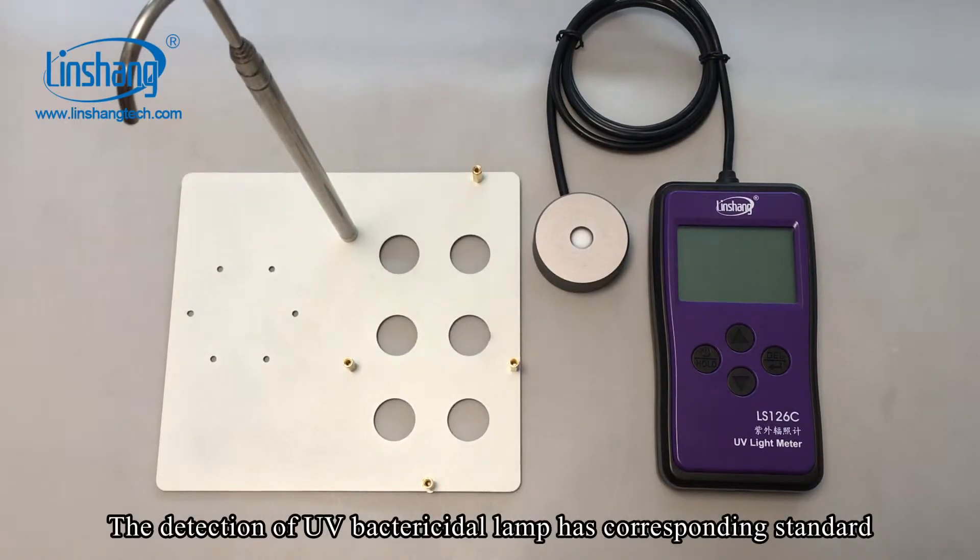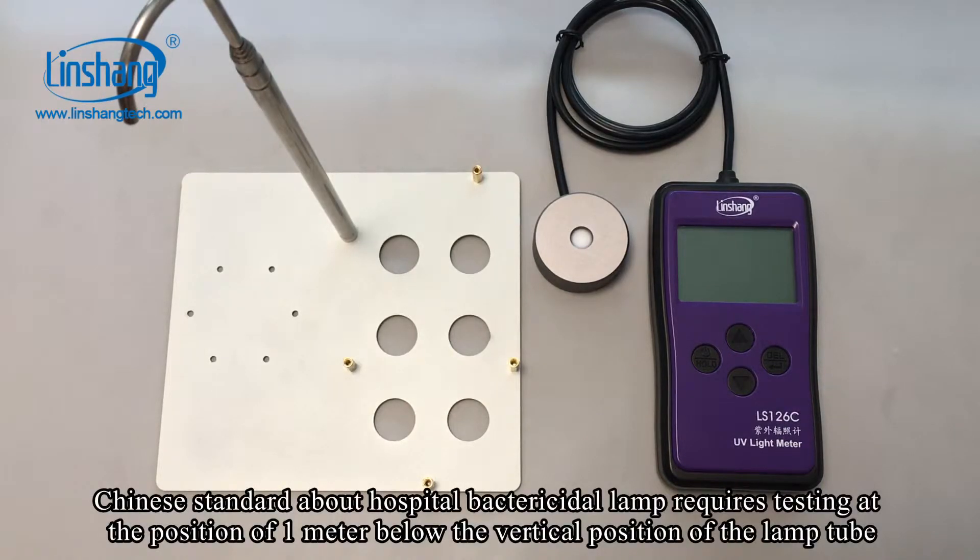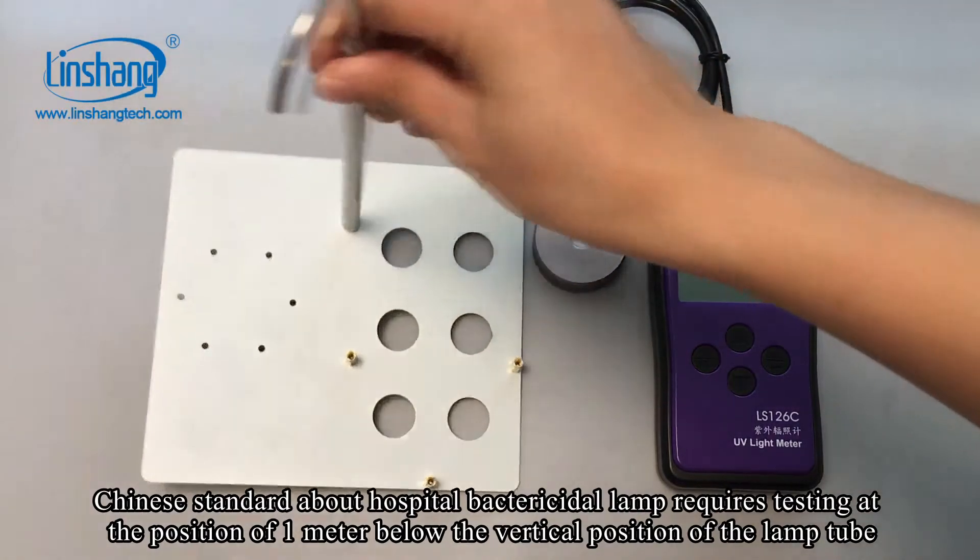The detection of UV bactericidal lamps has corresponding standards. The Chinese standard for hospital bactericidal lamps requires testing at the position of 1 meter below the vertical position of the lamp tube.